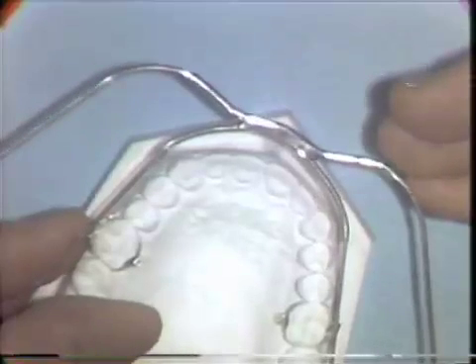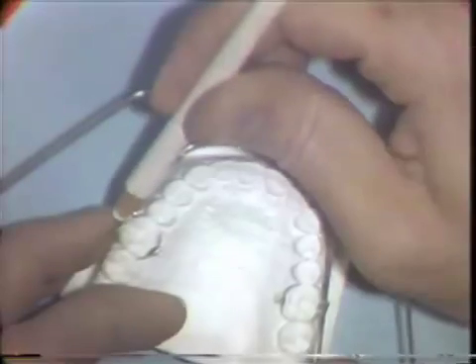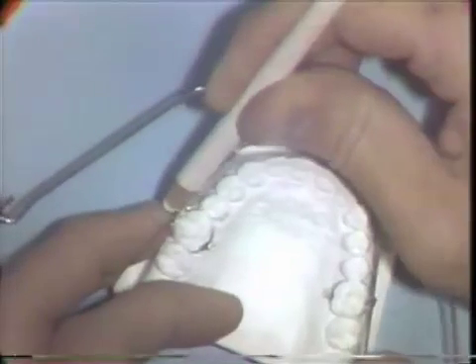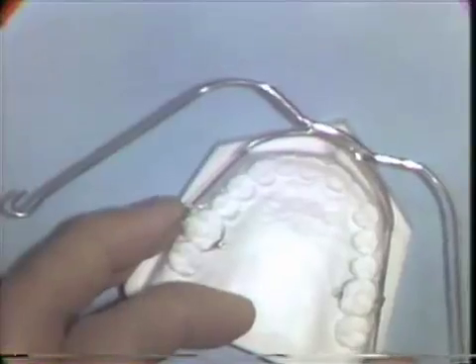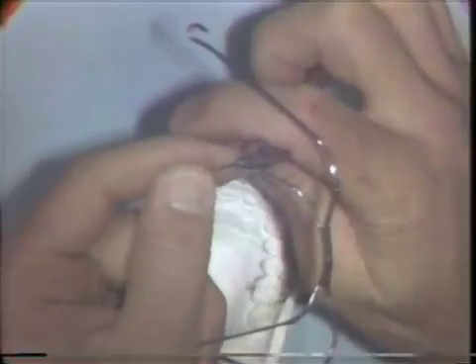The next step is to make a bayonet bend, and you mark the wire just at the mesial of the molar buccal tube. To make a bayonet bend, you grasp the inner bow at the mark and bend the wire inward. The beaks are placed just distal to that first bend, and an outward bend is made.